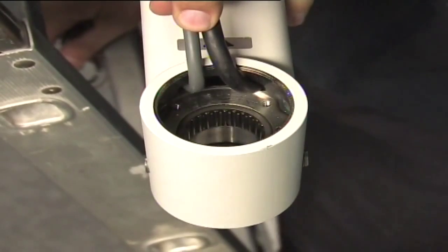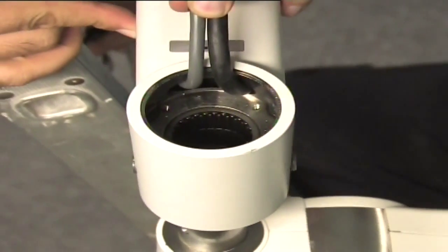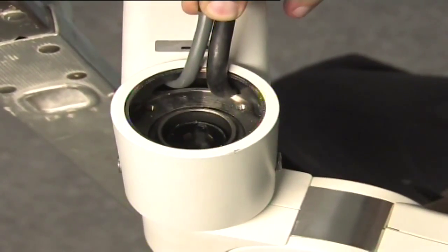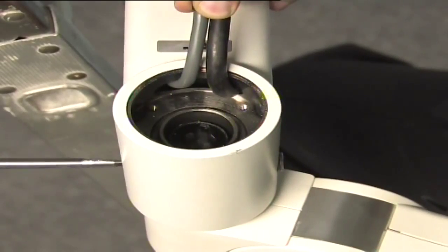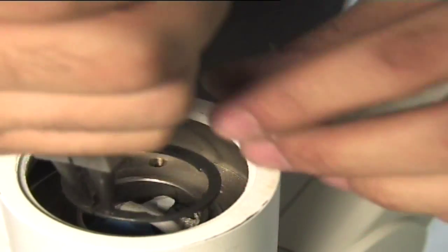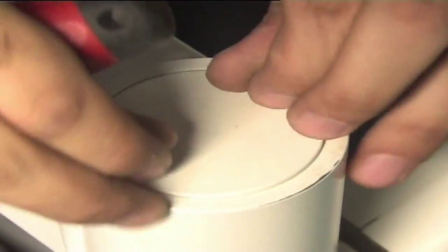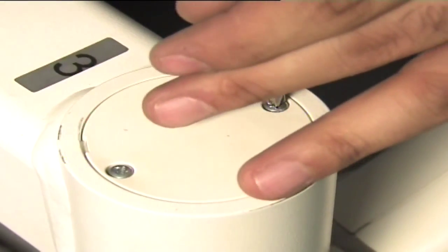Remove washer and segments which are fixed on arms first for raw spring arm assembly operations. Install spring arm to horizontal arm marked with number 3. After spring arm is installed to horizontal arm, please tighten fixing screw on horizontal arm. Place washer and segment afterwards. Make electrical socket connection inside the arm. Complete monitor spring arm assembly by closing top cover of the arm. Proceed with the same steps defined above for assembly of other spring arms.